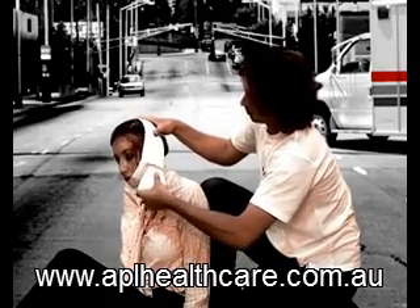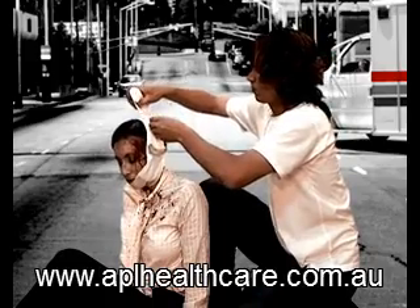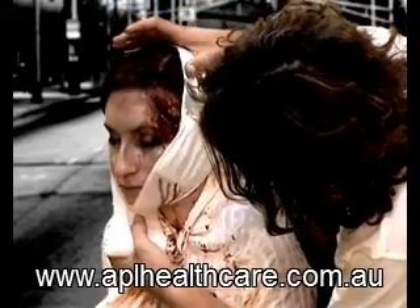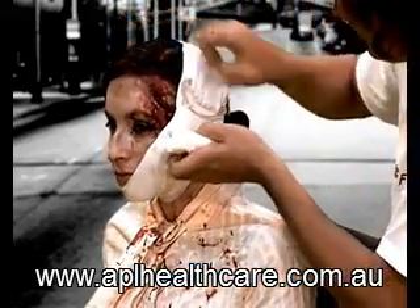Wrap the leader in revolutions around the head. The accumulated force of the bandage as it sits over the pressure applicator creates increased pressure directly on the wound site. Continue wrapping the bandage around the head.